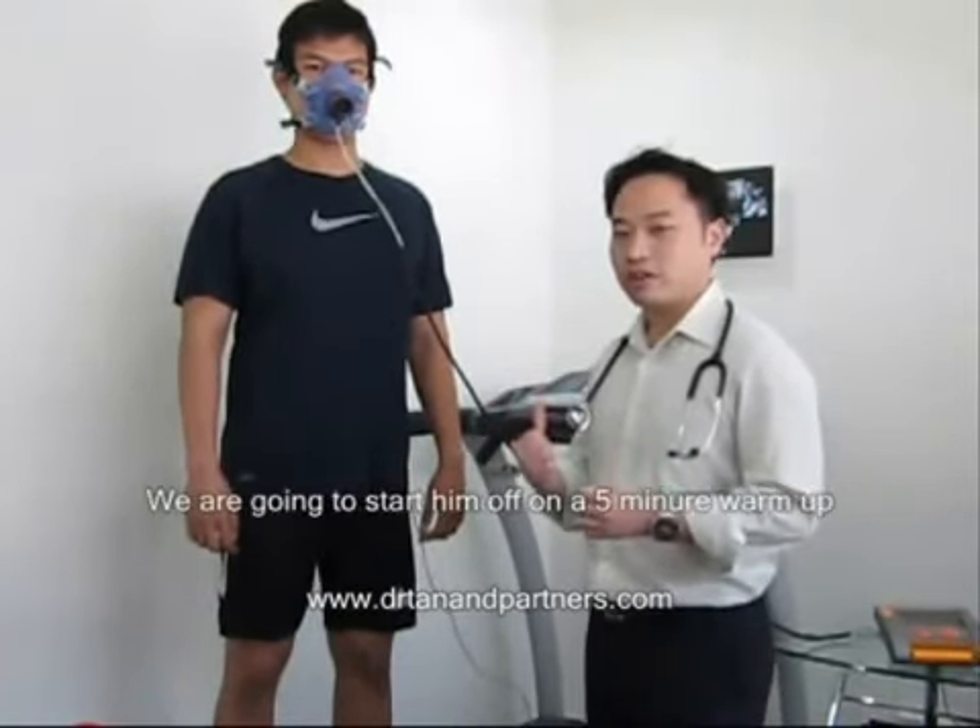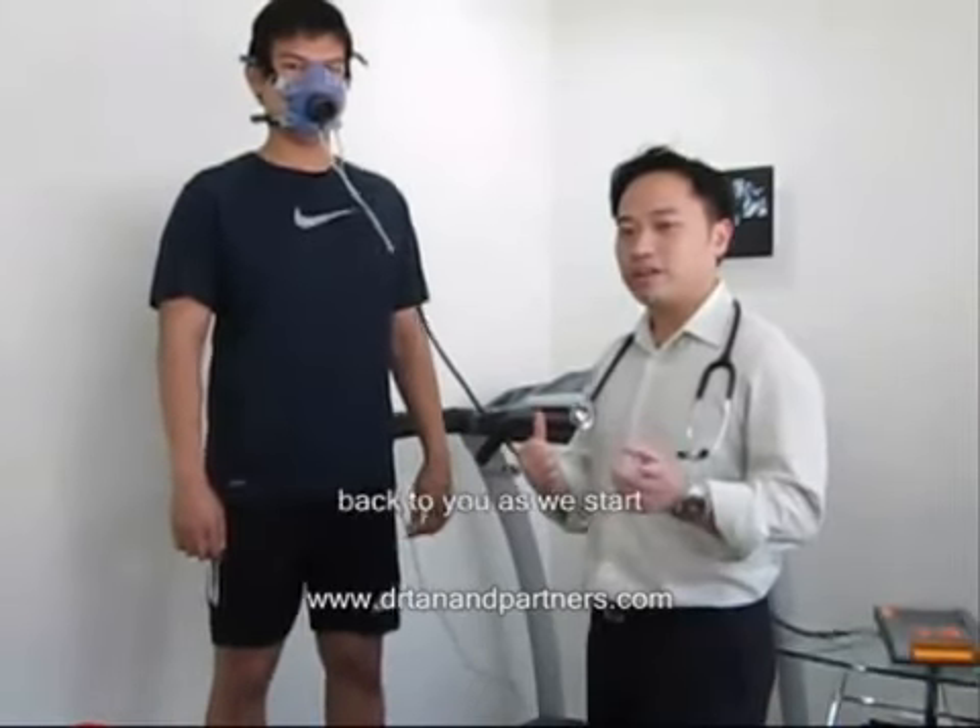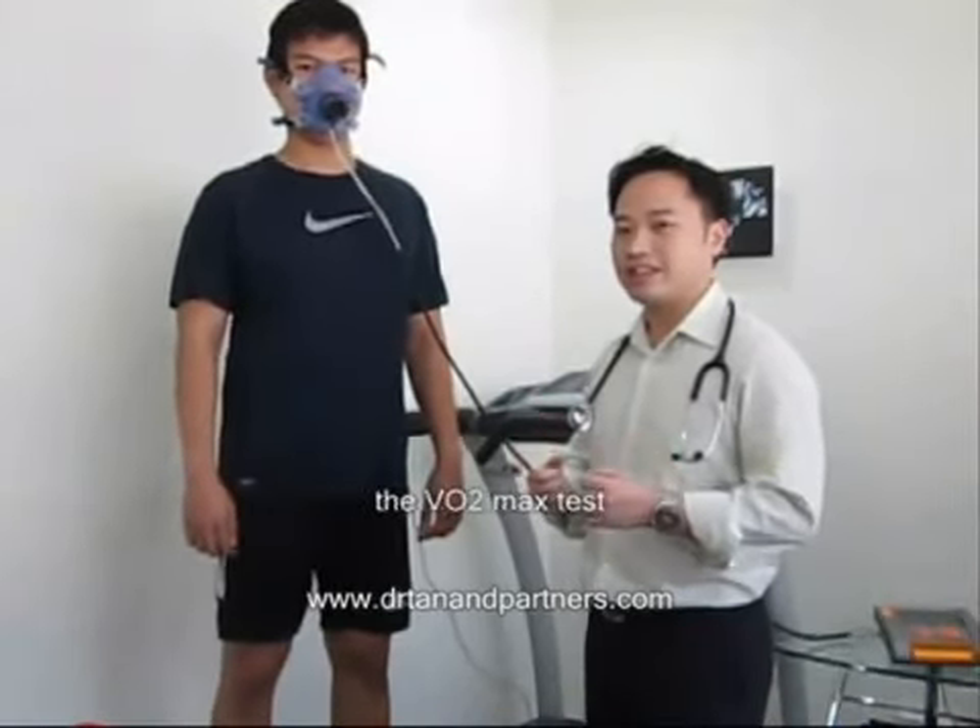We will start him off on a five-minute warm-up, and then we will get back to you as we start the VO2 max test.